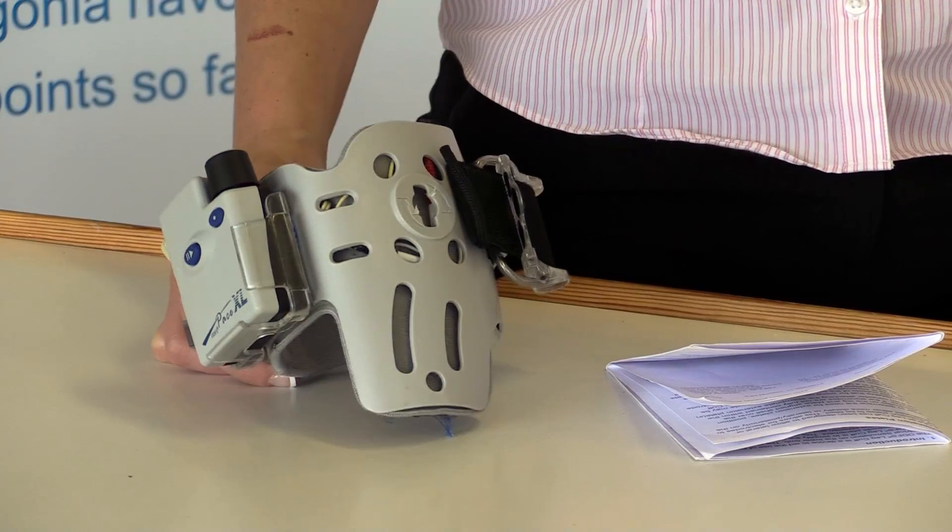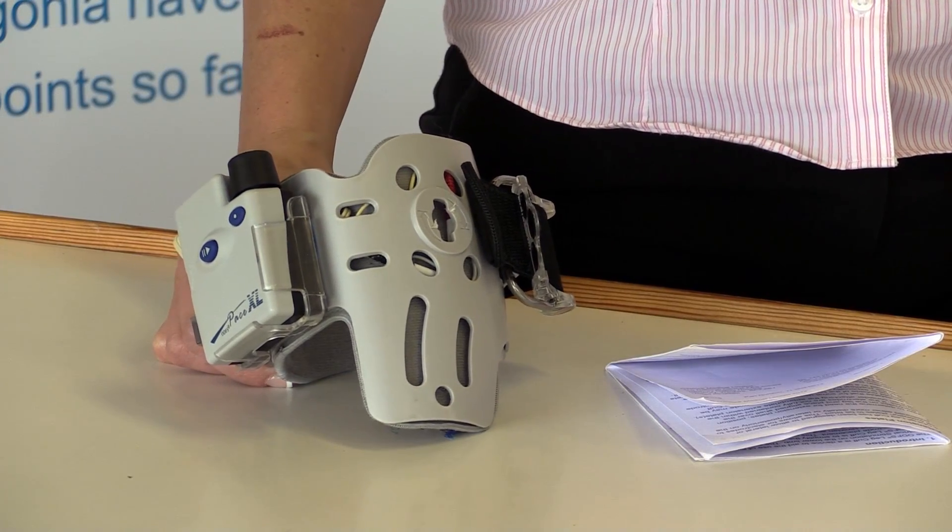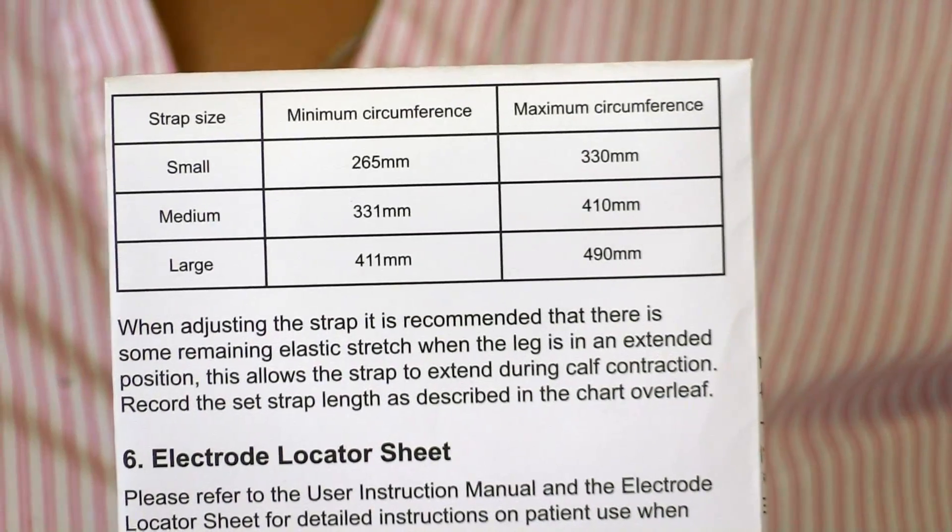This video shows the setup of an ODFS leg cuff. The leg cuff comes in one shell size, but there are three strap sizes: small, medium, and large. It's important to identify which strap size an individual requires by measuring the circumference of their leg at the head of the fibula, and then refer to the size guide to identify which strap is needed. Our customer service team can help with that.